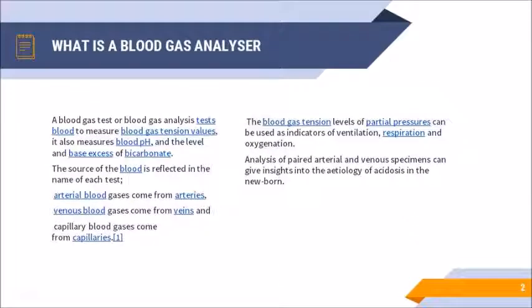Today we will be discussing blood gas analyzers, the technical specifications and conditions to be taken into consideration while purchasing a blood gas analyzer.